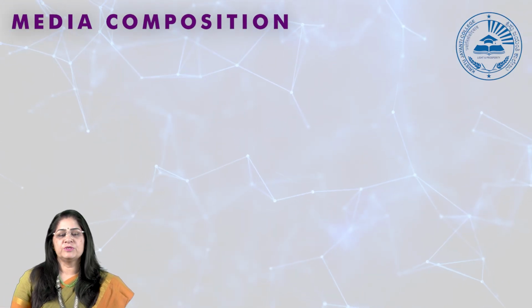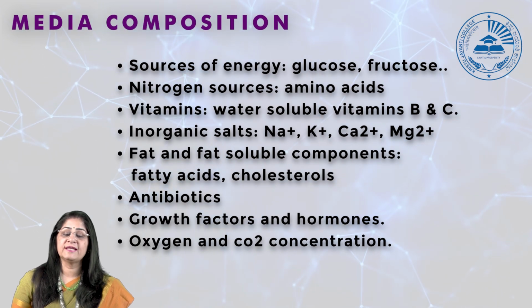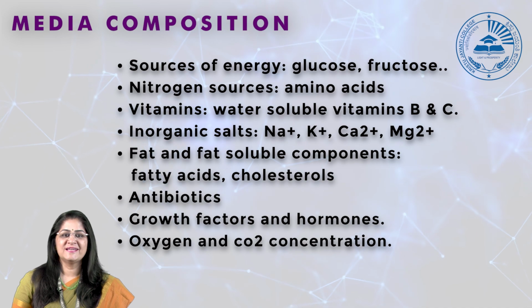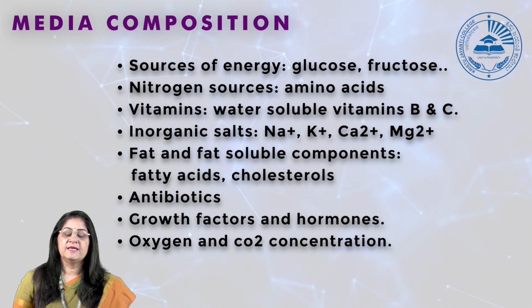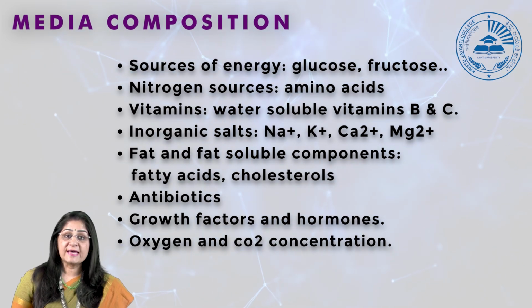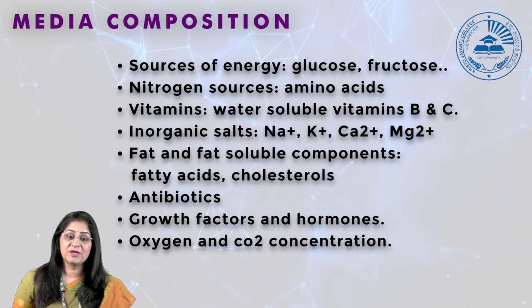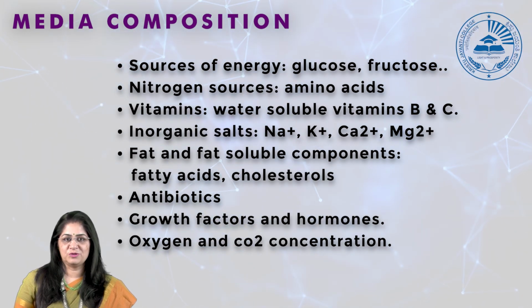So the media composition: what does the media contain? It contains sources of energy like glucose and fructose, nitrogen sources like amino acids, water-soluble vitamins, vitamins B and C, inorganic salts such as sodium, potassium, calcium, magnesium, fat and fat-soluble components, fatty acids, cholesterol, antibiotics, growth factors and hormones, and oxygen and carbon dioxide concentration.